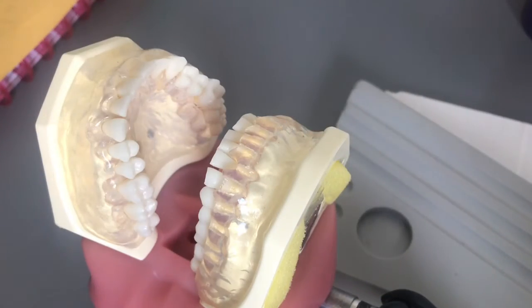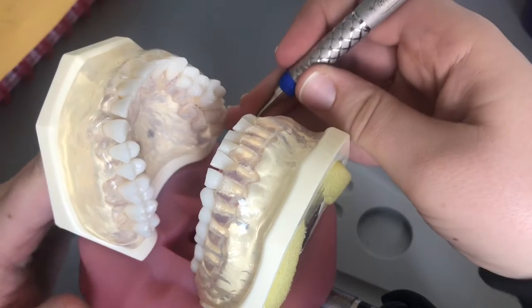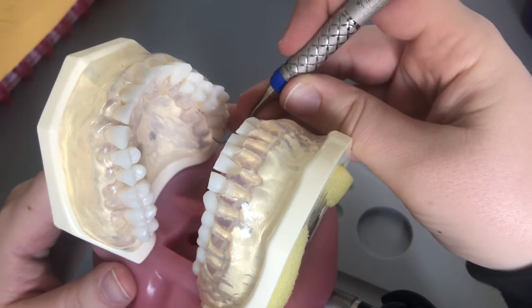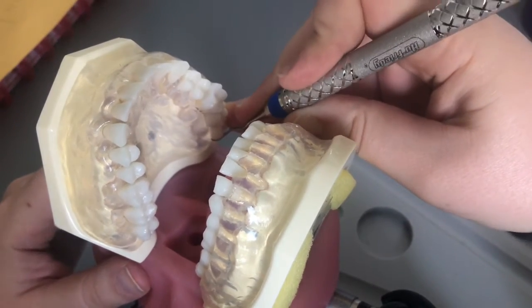Alright, now I'm on my third must-see area and I'm doing the maxillary left linguals here. Again, make sure you have the correct working end or you won't be on the correct cutting edge. I always second guess myself. A little hard with the camera here, but we're gonna make it work.